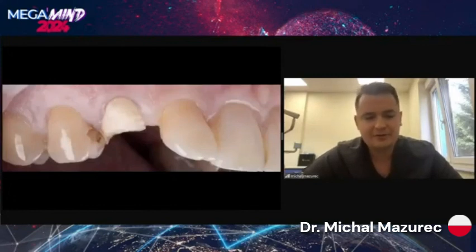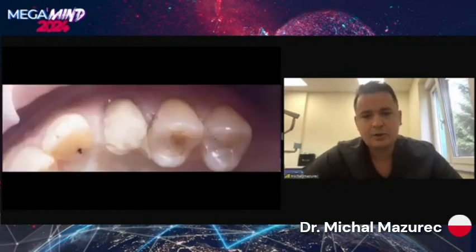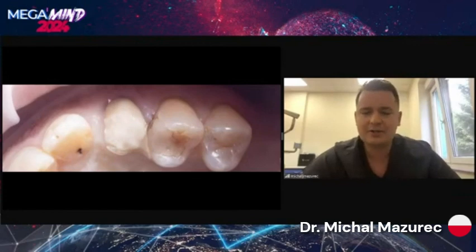The patient is a 34 year old gentleman with no allergies, no general diseases, generally healthy. And what we see here is a very big, very long root. If we go with the classic approach with extraction, grafting and soft tissue grafting, the most crucial thing will be the extraction of the tooth. It was a 22 millimeter root. As you know, with very thin buccal bone, it's very, very difficult to do it and not break the buccal bone. So in these cases, PET should be considered as the first step, which is much more predictable in the case of the surgery.